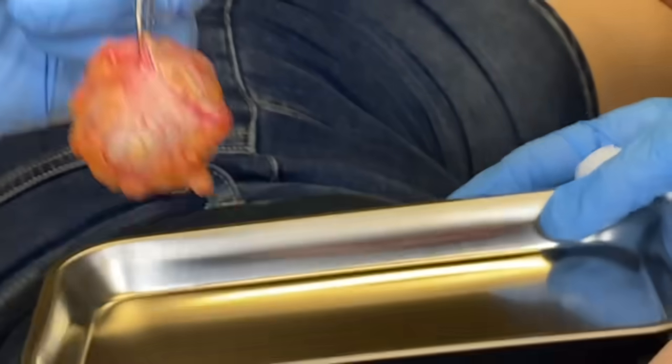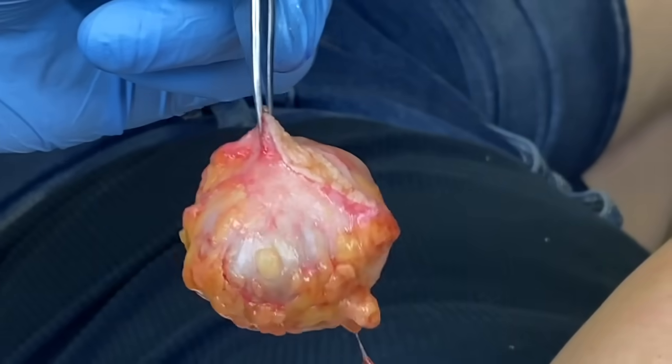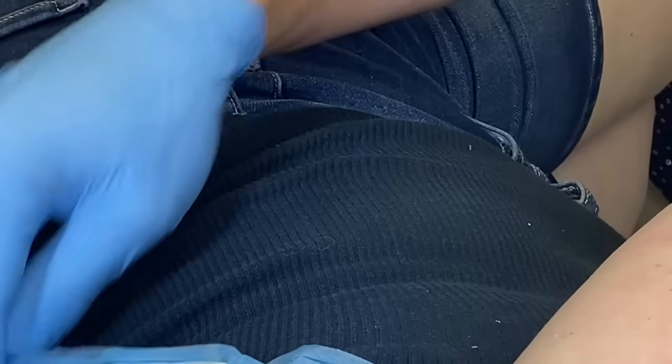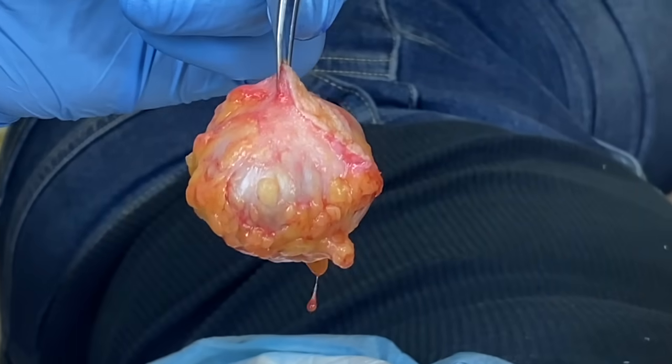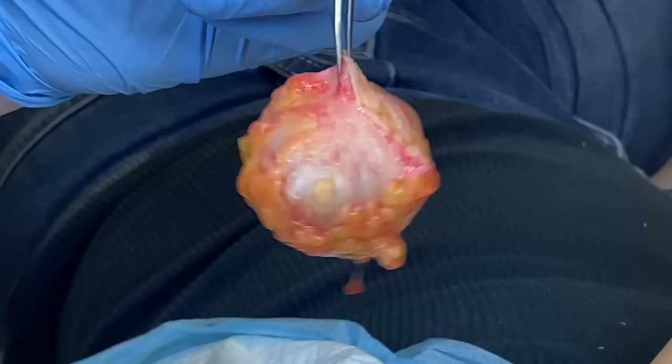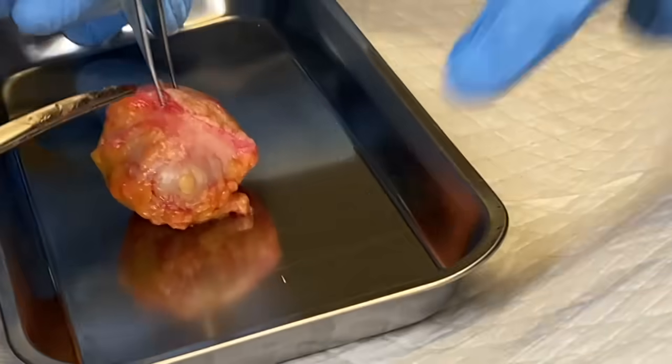And that is it. Just put a blue drape over top of her there, if you don't mind. I think I'm going to get another one. The patient's brought an assistant with her today, who wants to take a picture, so we're going to let her take a picture of it.